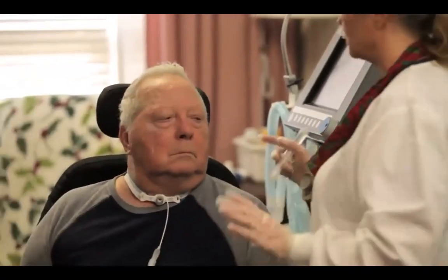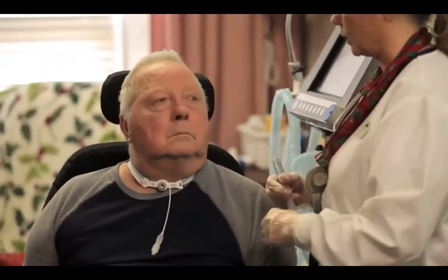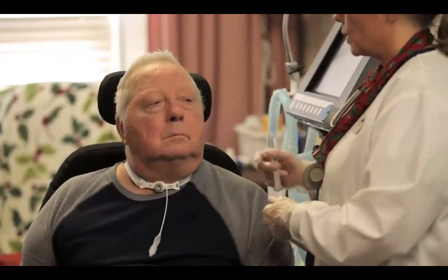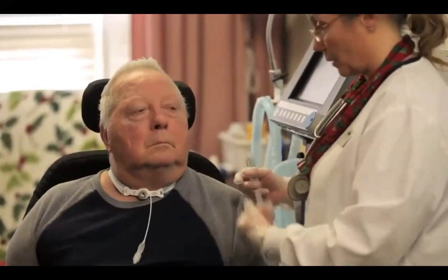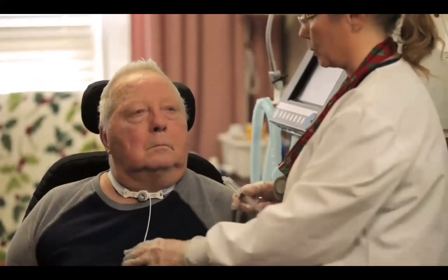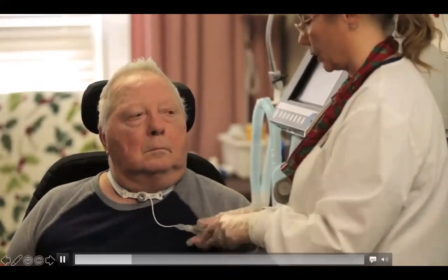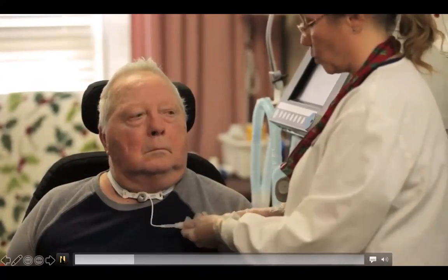But you're going to feel air start to come up around the cuff, okay? Or up through your nose and mouth. And if you think that you have secretions that you might feel go by, you'll probably have to cough, and that'll be natural. If there was a lot, then we'd have to look at suctioning more.